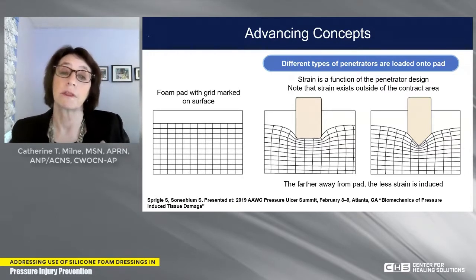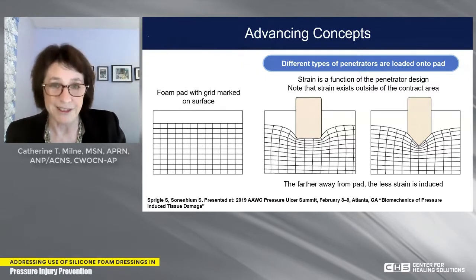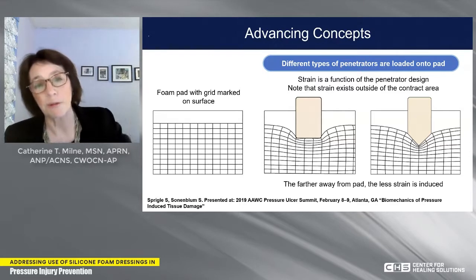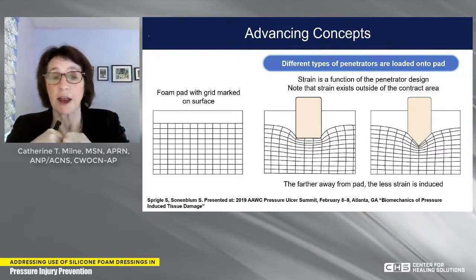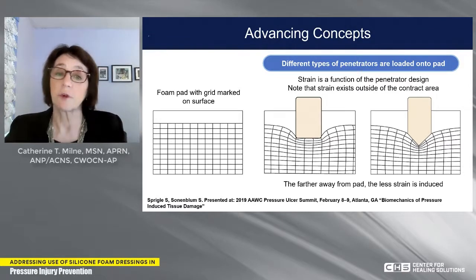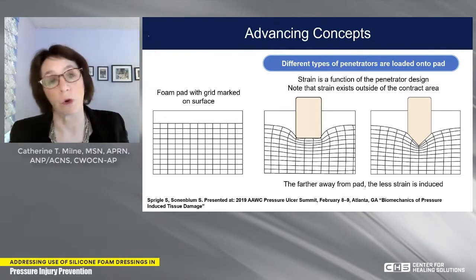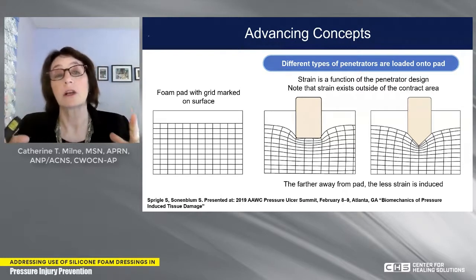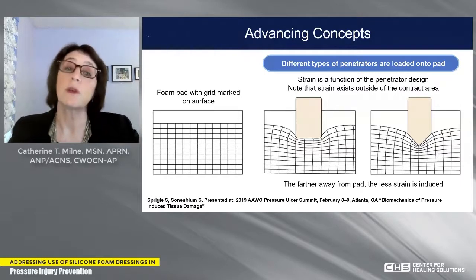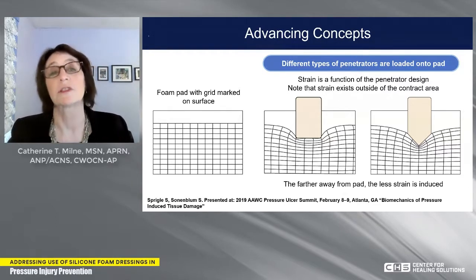So you have to think about that when you are figuring out the size of a dressing. Foam dressings come in many shapes and many different sizes, and so does your strain. So you have to think about what has been applied to that patient, where that strain is most deformed, which would be most at the center of that area, but we also have to think about the strain and the stress that's further out. If we don't cover that area with a foam dressing, we are going to re-injure that area and decrease that tissue tolerance over and over again. So we talk about having enough dressing to cover the wound, but we actually need a little bit more of the dressing to cover this shear strain that has been affected, so we don't sensitize or allow our sensitized skin tissue tolerance to break down itself.